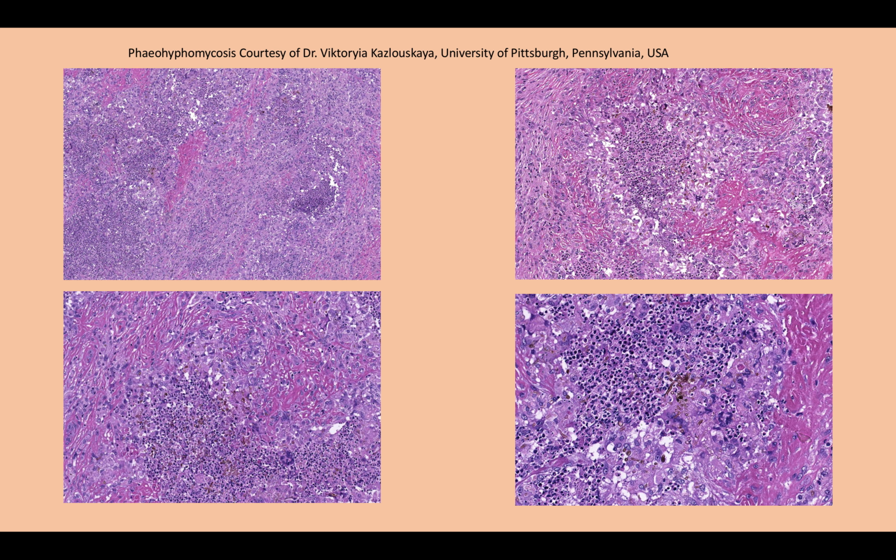Sometimes blastomycosis-like reaction pattern can be due to phaeohyphomycosis. This is an infection which may occur in immunosuppressed patients, or as we see it more common in dermatopathology, it presents as a subcutaneous implantation cyst. And this lovely case shows it very, very beautifully.